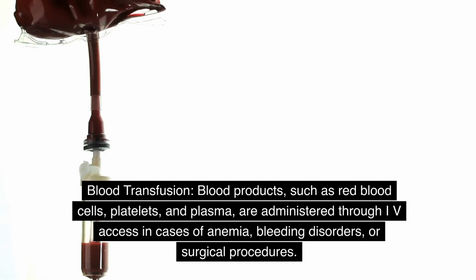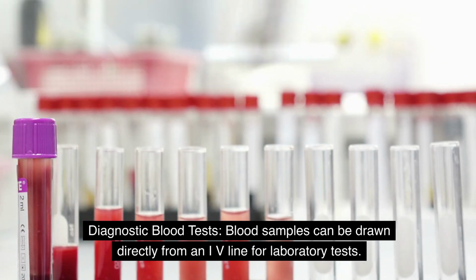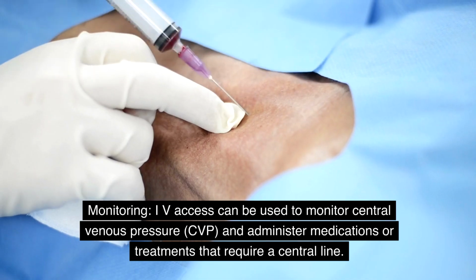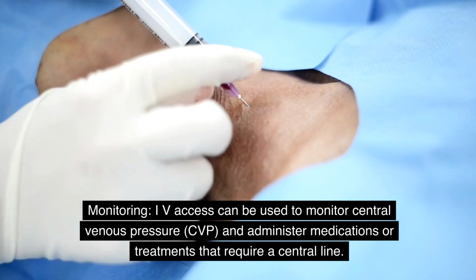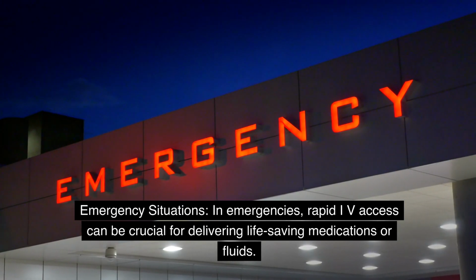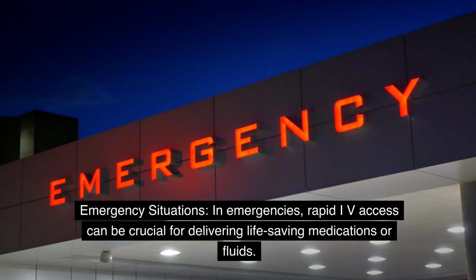Blood products, such as red blood cells, platelets, and plasma, are administered through IV access in cases of anemia, bleeding disorders, or surgical procedures. Diagnostic blood tests. Blood samples can be drawn directly from an IV line for laboratory tests. Monitoring. IV access can be used to monitor central venous pressure, CVP, and administer medications or treatments that require a central line. Emergency situations. In emergencies, rapid IV access can be crucial for delivering life-saving medications or fluids.